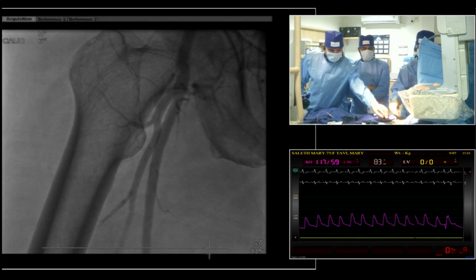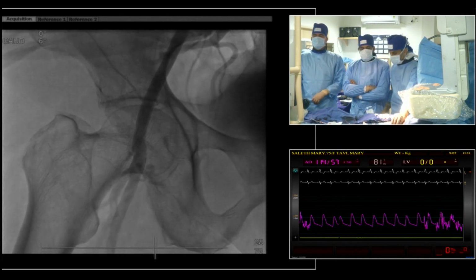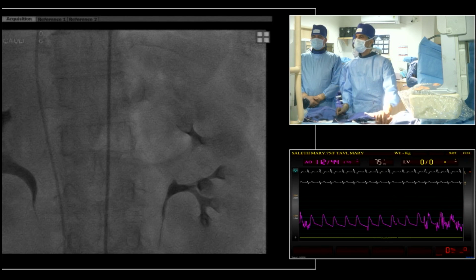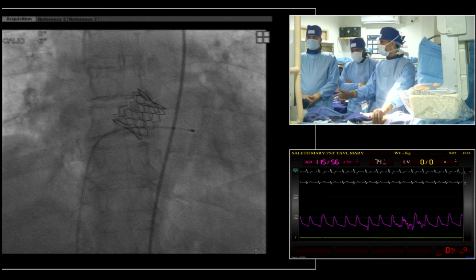So yeah, I think I would send the patient to the CCU with the wire, but I'm not necessarily going to keep it overnight. I would actually pull it out at the moment, I'm more comfortable with that. Because it's a new onset, I just observe it for a few hours, but not overnight at all.